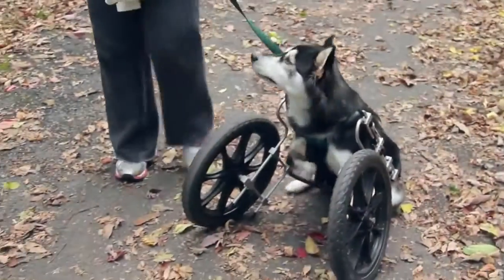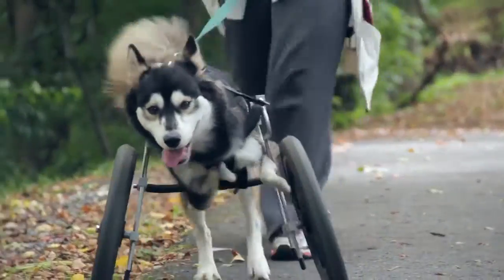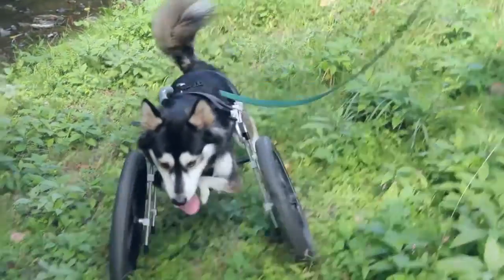We decided to get him a cart, which worked quite well, but they limit his mobility in terms of being able to play with other dogs and it's not really the full motion of running.